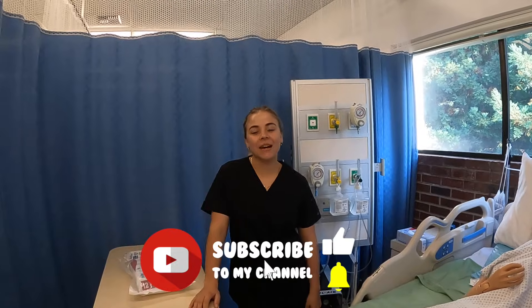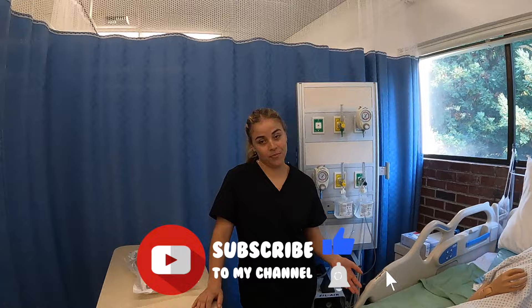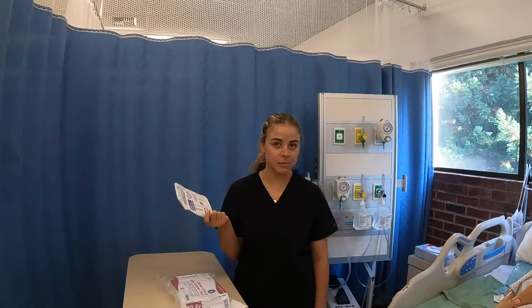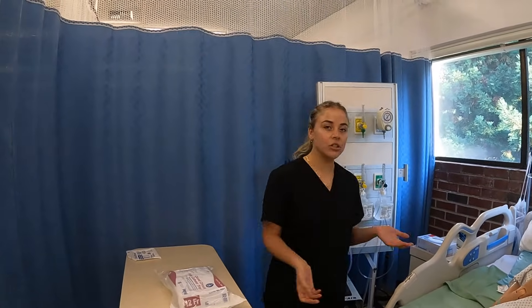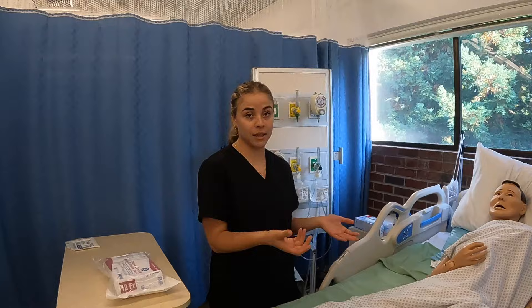Hi, it's Nurse Samantha, and today I'm going to be teaching you how to insert a Foley catheter into a male. As you can see, I have my kit here, and then just a personal preference because I have bigger hands, I have the size that I need, which is a seven and a half of sterile gloves. We would introduce ourselves to the patient, perform hand hygiene, and then explain what we would be doing to the patient.